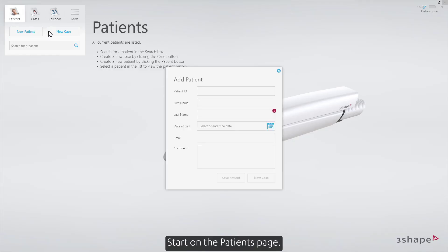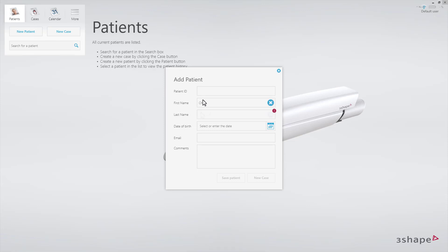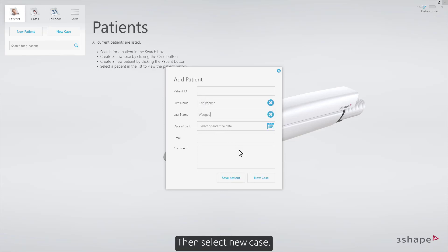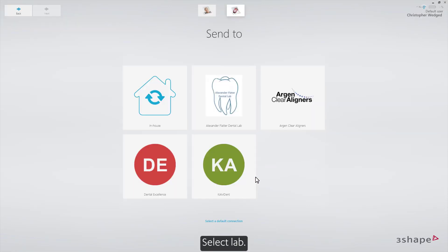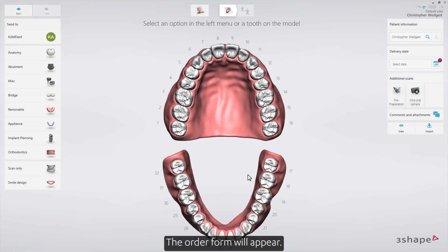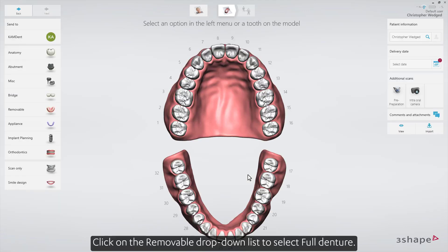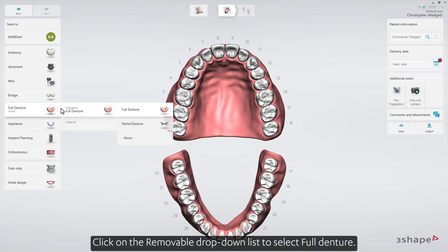Start on the patient's page, create the patient, then select new case. Select a lab. The order form will appear. Click on the removable drop-down list to select full denture.